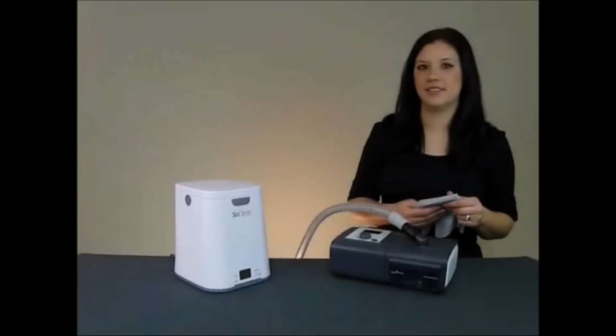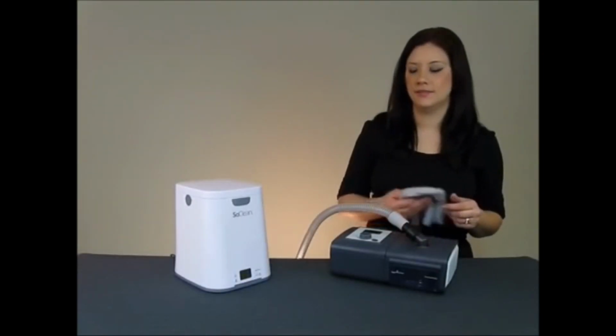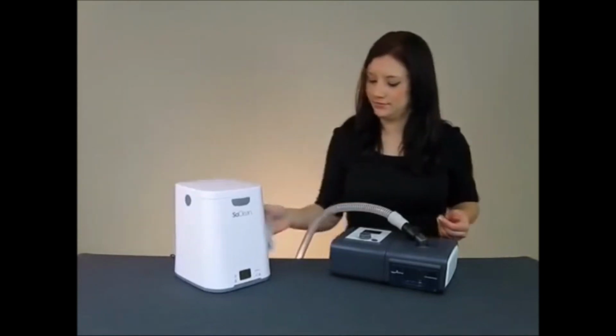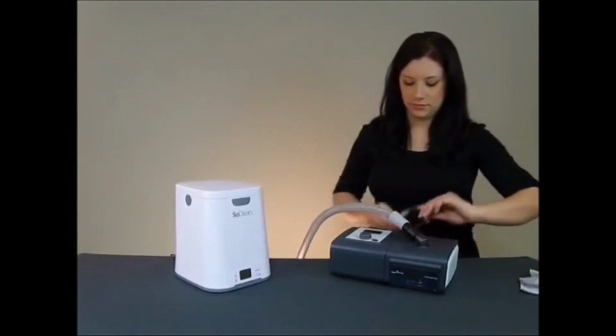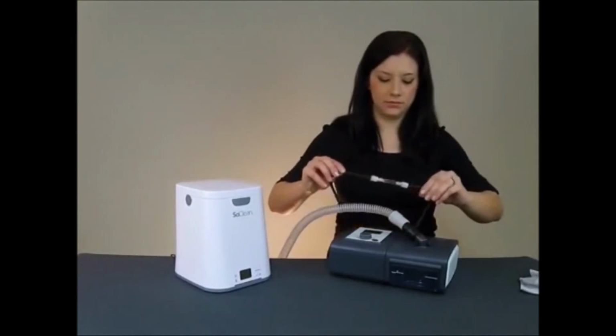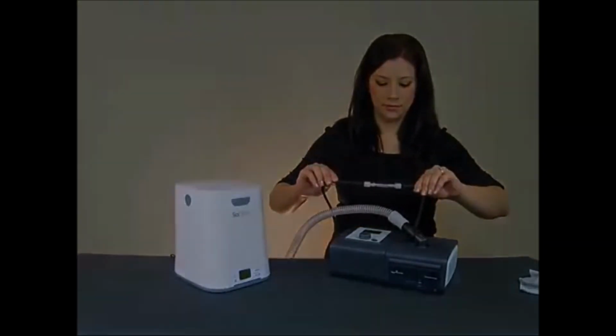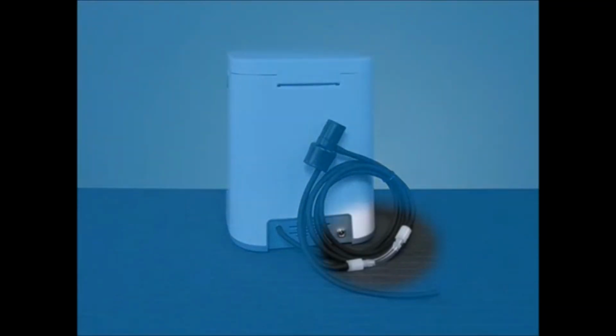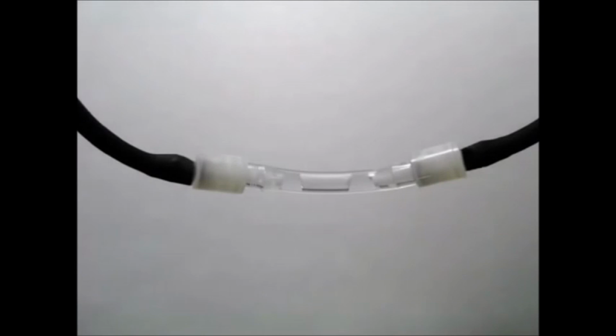Very little is needed when it comes to looking after your SoClean. Keep it clean and dust-free by wiping it down with a damp cloth when necessary. The check valve assembly, located along the length of black hose, plays an important role in the SoClean's operation. This system prevents water in your humidifier reservoir from backing up into your SoClean.